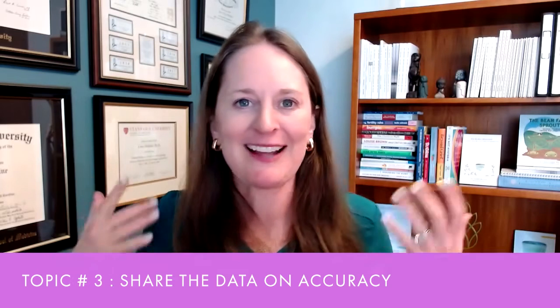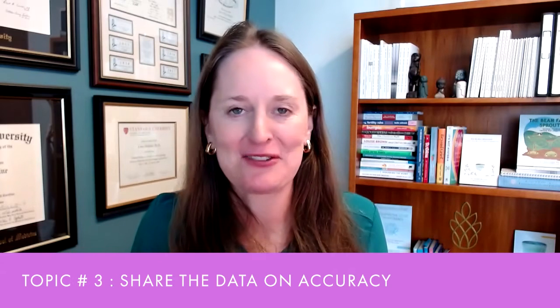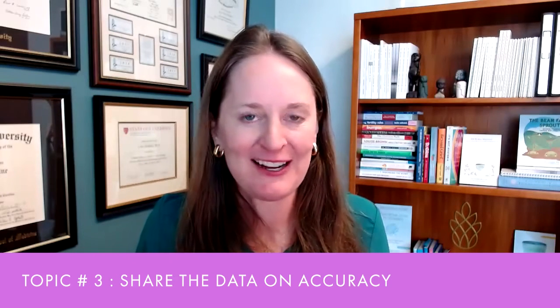So topic number 3, how good are these tests at trying to find what they're looking for? Because no test is perfect. And there are absolutely times where people have been told, I have blocked fallopian tubes. My HSG showed that my tubes are blocked. And then they find out later that actually one or even both of their fallopian tubes are open.